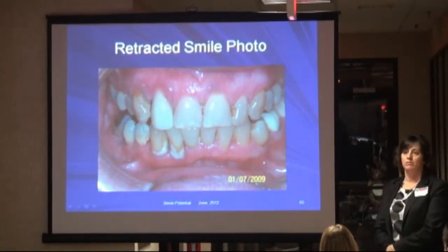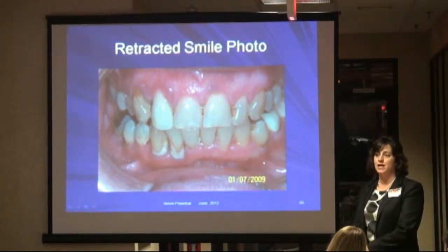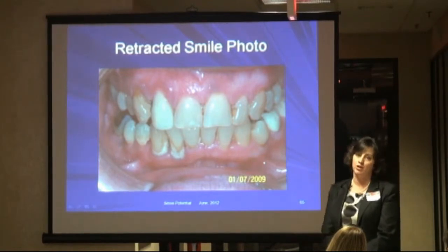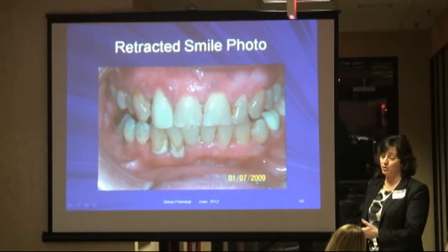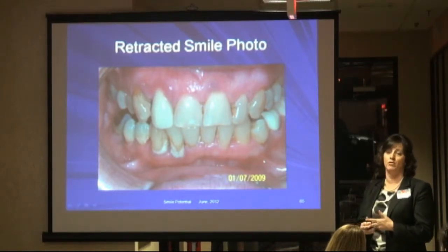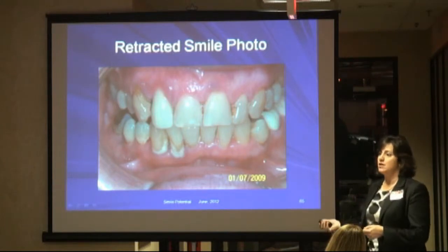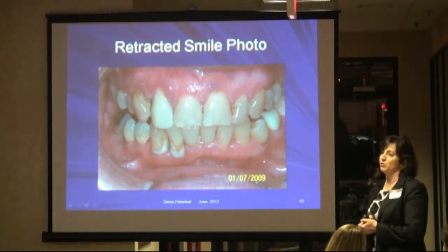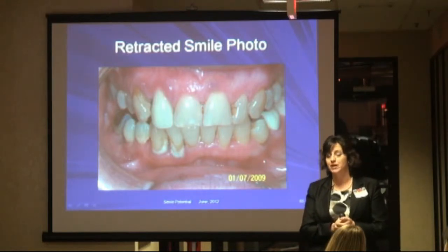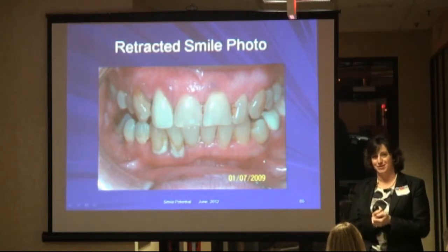Retracted smile photo. This is something that is grossly overlooked in most practices, even the practices that are really great with the intraoral camera. This is a skill that a lot of practices have not mastered. Either they don't have the right camera, or the people within the office do not have the skills to use the appropriate camera, so they just skip it. This is a huge practice builder, taking a retracted smile photo on every patient, obviously on your new patients, but if you've not been doing it routinely, then every patient becomes a new patient if you do it on your entire patient base.